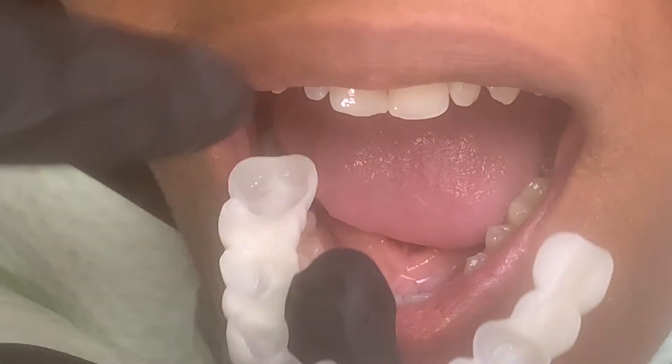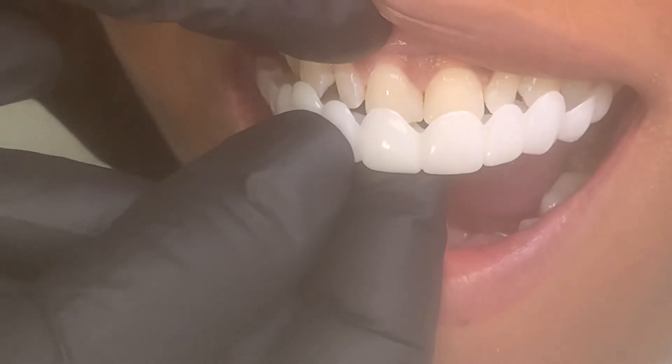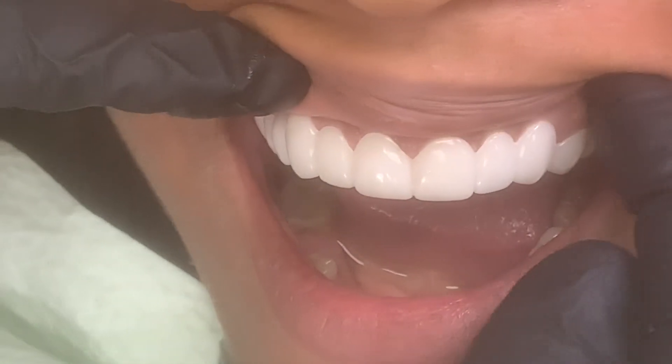So we're going to go ahead and place it in. We did change the color. Look at this — this thing is gorgeous, and it fits passively over the gum right at the gum line in her case. Literally snaps into place. Look at that — it's gorgeous. Look at the gum line, it's perfectly contoured.